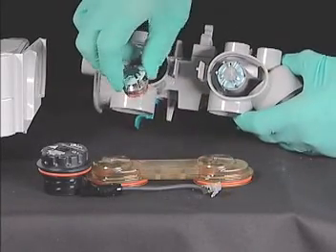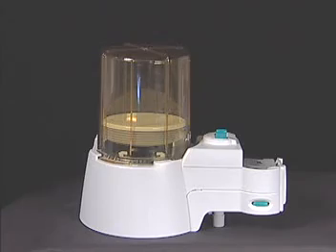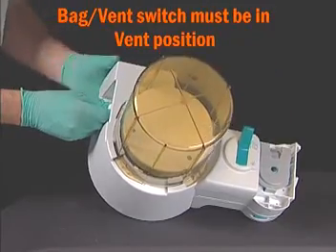Reach in to remove the check valves. The bellows and bellows canister can be autoclaved while attached to the ABS bellows base. Place upside down so that the bellows is completely extended.